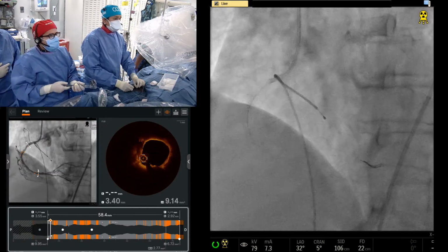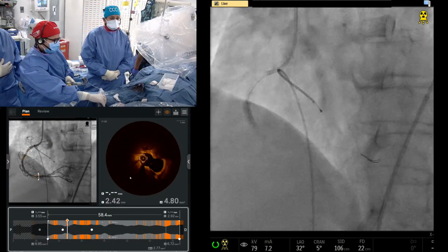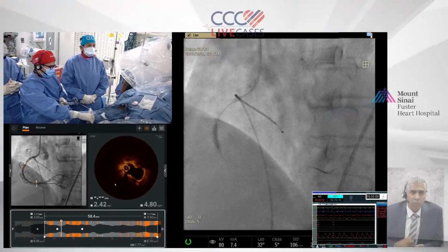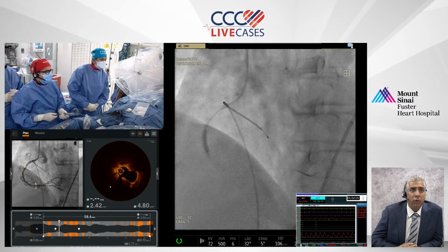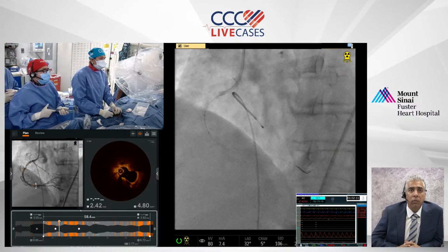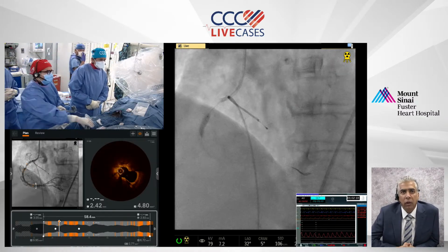Okay, good here. Maybe a couple more pulses at the proximal nodule where we really had a tough time with the rotor. Yes, Nitin? Especially with the 4.0, on the IVL it's really important to prep it repetitively in between inflations. There's some cavitation that occurs, so with subsequent inflations the sound waves may be less efficacious if there are bubbles that form in the balloon itself. Okay, go there. But it looks good.